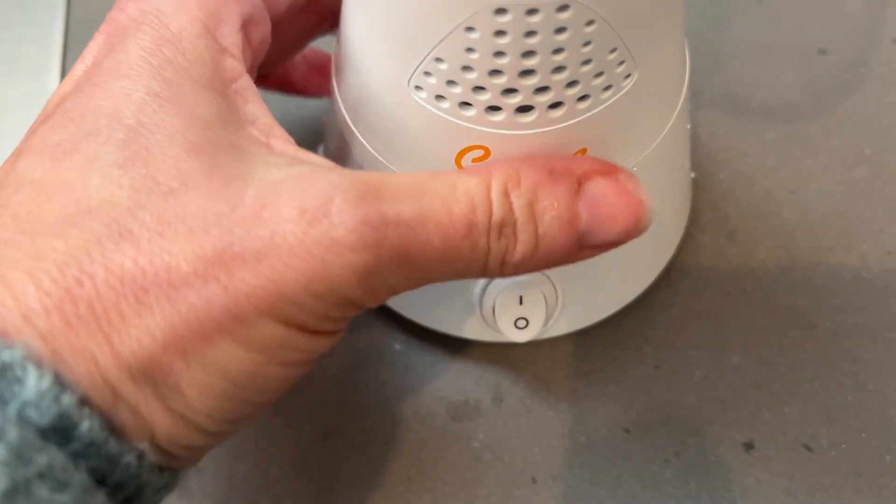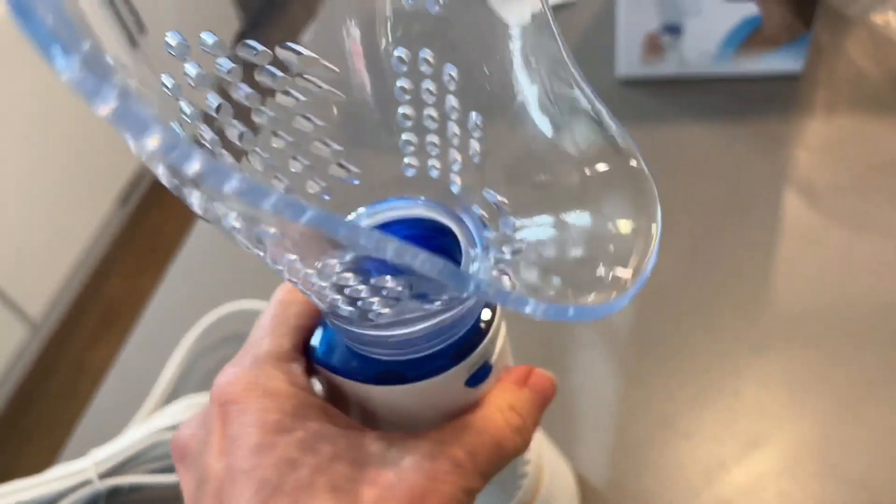The best part is it has an automatic shut-off feature, which means it will shut down when the water level is low.